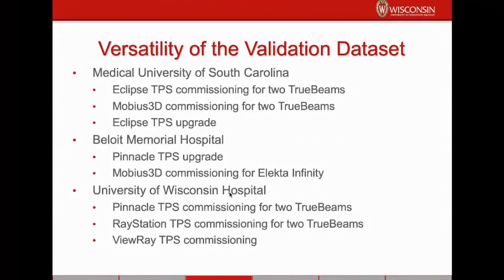At the University of Wisconsin, we've gotten 2 new TrueBeams, actually 3 new TrueBeams now, in the last 5 years or so. We commissioned them in Pinnacle, and then a few years later, we commissioned them again in RayStation. After doing MPPG 5A in Pinnacle, doing it in RayStation was very easy because we had the same set of data that we could use.